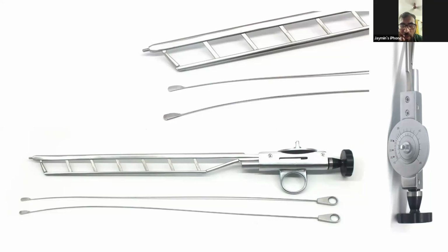The knife, sir, goes inside the groove, and when it is completely fit inside the groove, it is not to be seen from above. The graduation, the calibration, is from 15 to 45 French for this urethrotome, so it can be dilated to 45 French. There is a thumb holding channel with the knob on the top and the graduation scale. Then there is the straight urethrotome with the groove in which the knife passes. Sir.